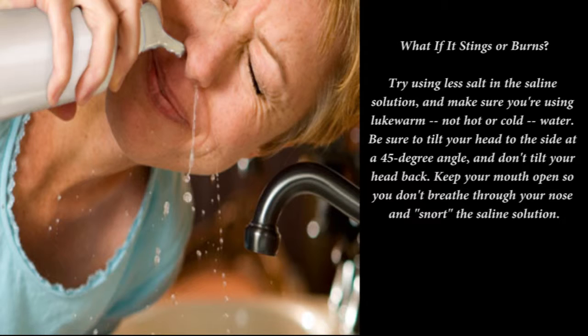What if it stings or burns? Try using less salt in the saline solution, and make sure you're using lukewarm, not hot or cold, water. Be sure to tilt your head to the side at a 45-degree angle, and don't tilt your head back. Keep your mouth open so you don't breathe through your nose and snort the saline solution.